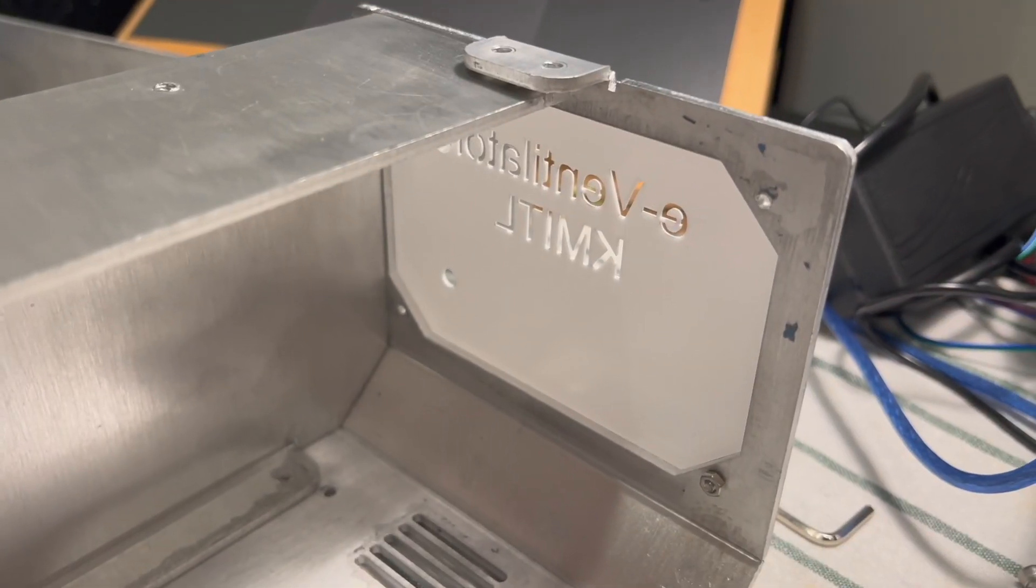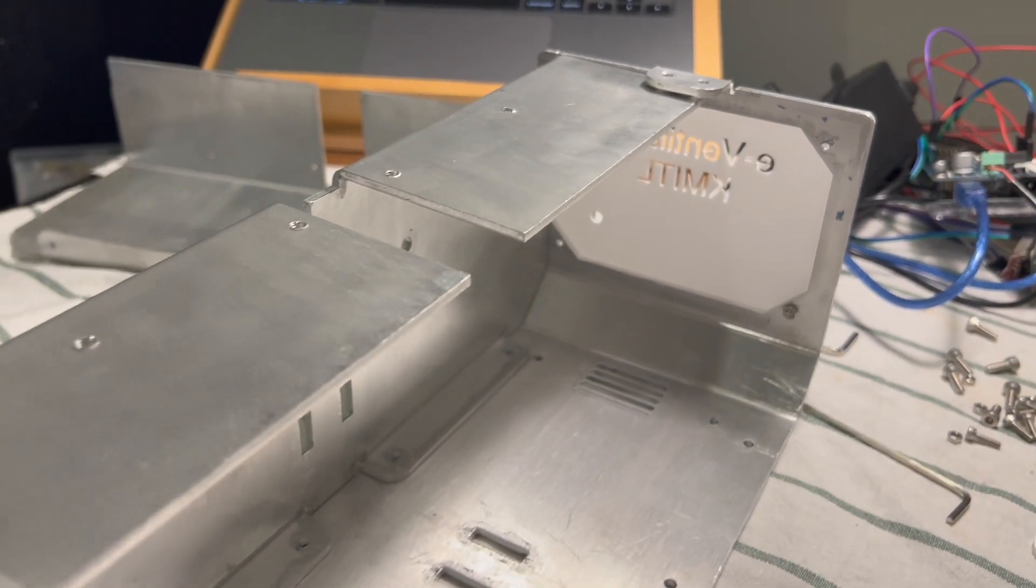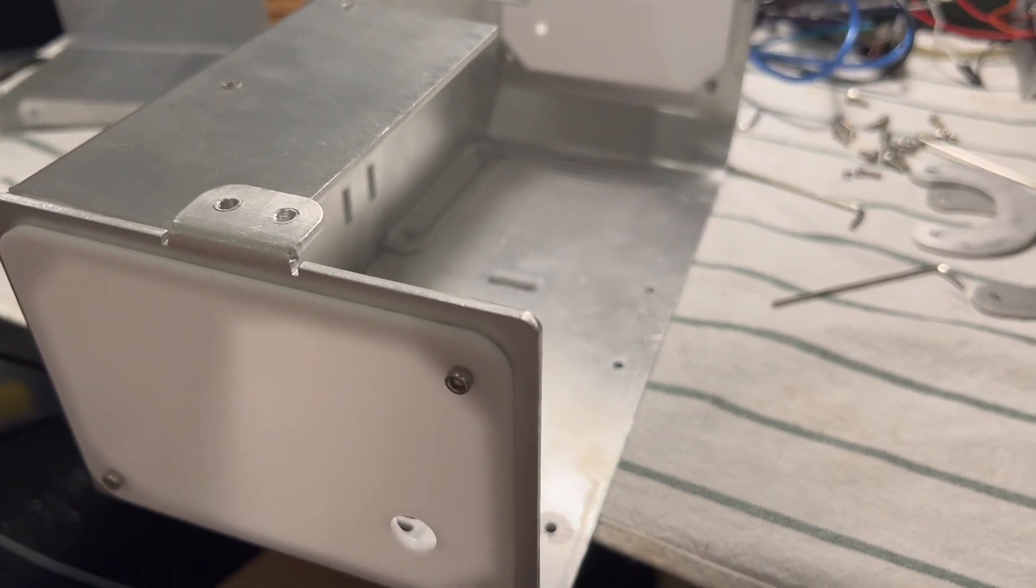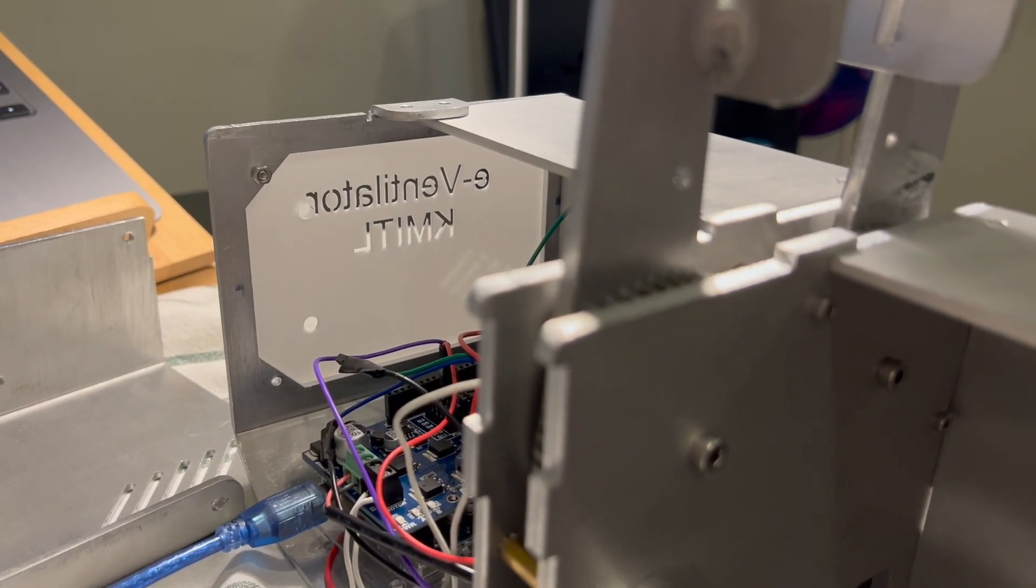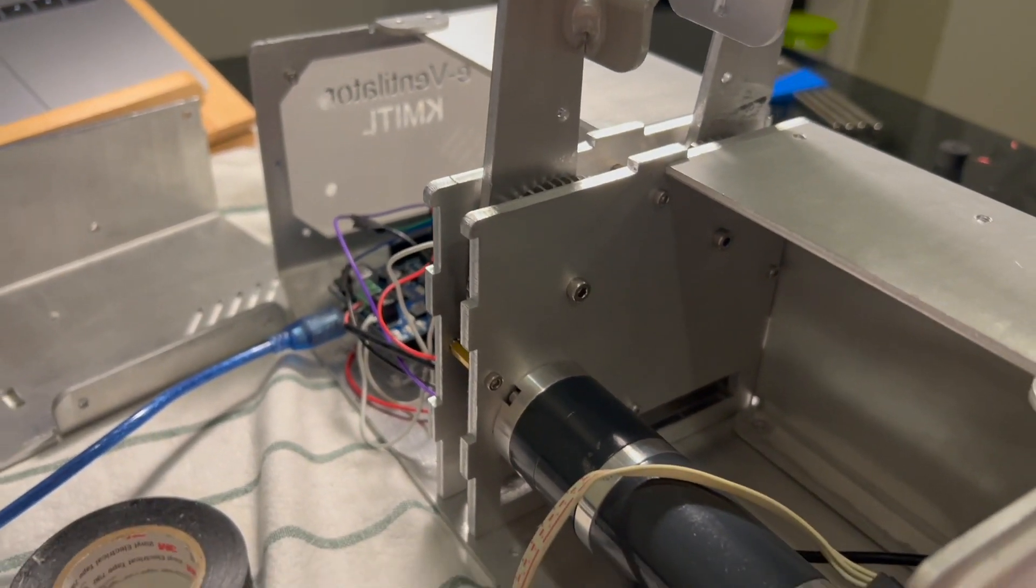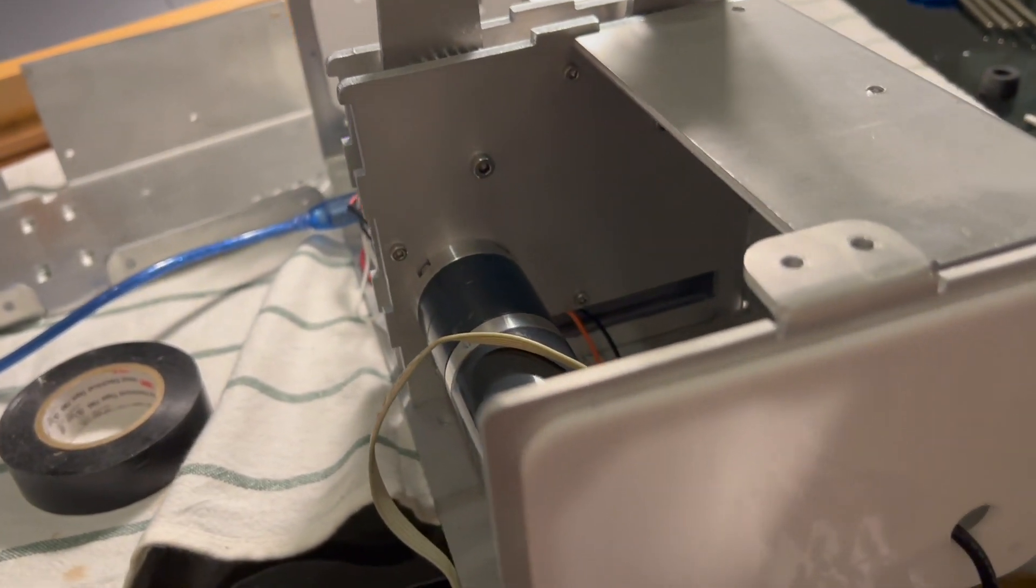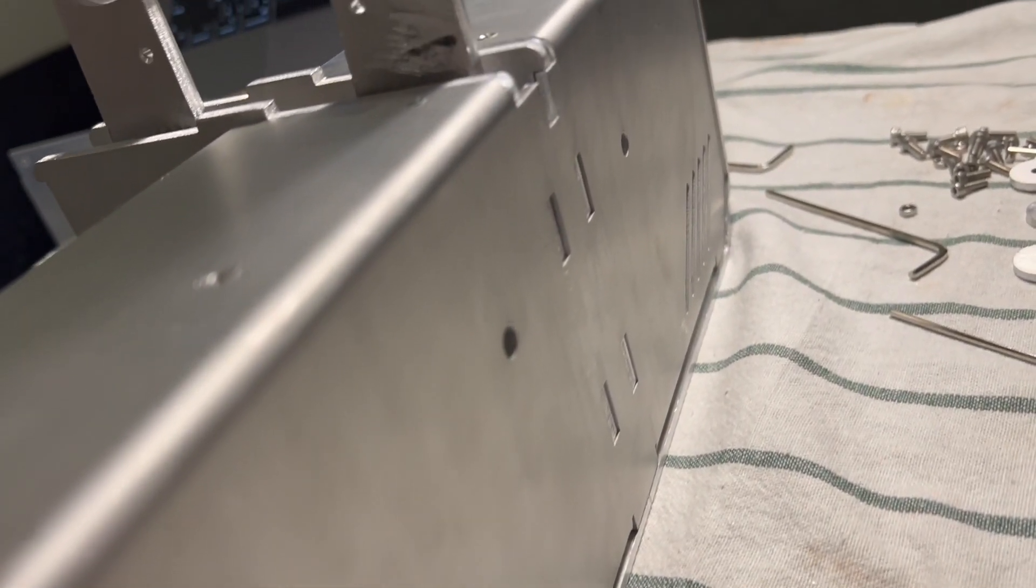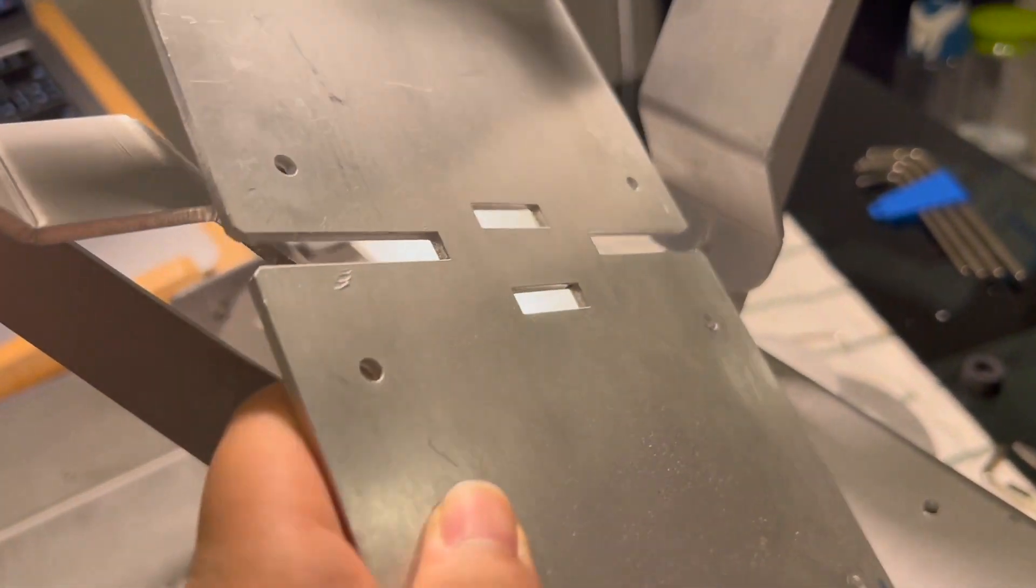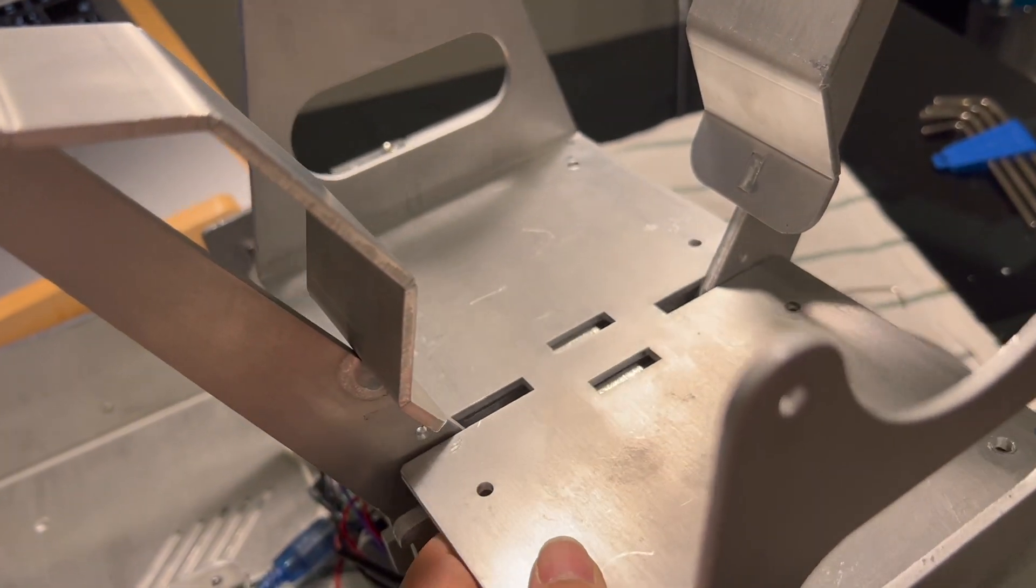Our emergency ventilator consists of two modes. First is the continuous mandatory ventilation or the CMV mode. This is a type of mechanical ventilation in which breaths are given by the ventilator. The patient cannot breathe at all. The ventilator will run at the parameters which we set.